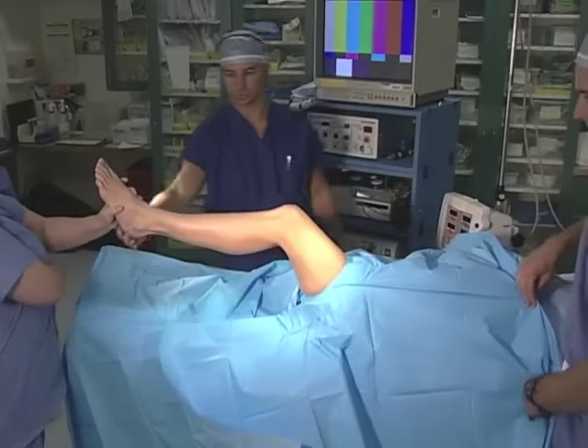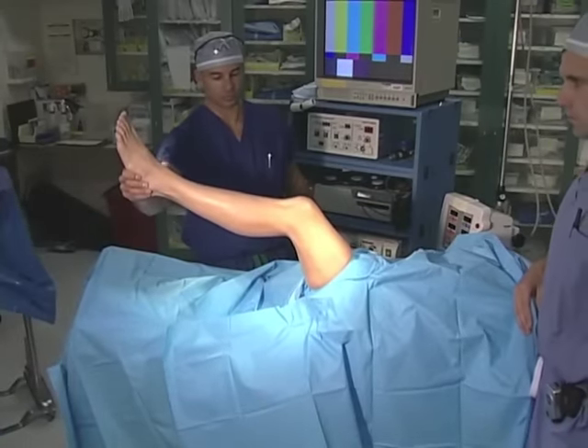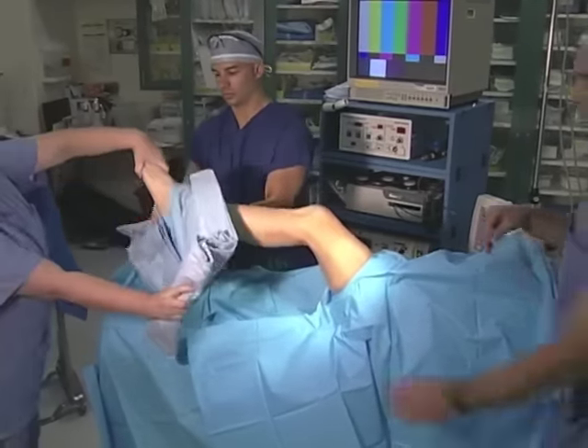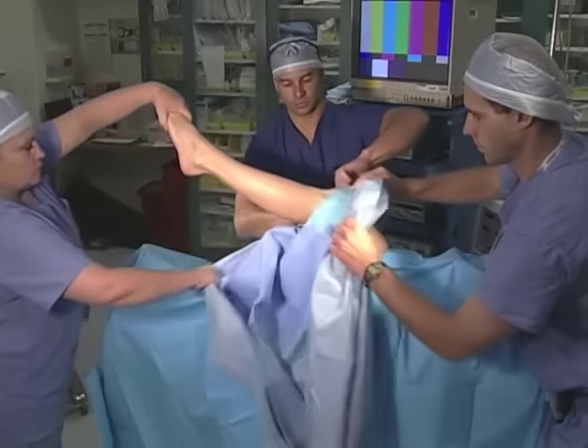Finally, an arthroscopy drape is positioned over the foot. These generally have a hole or diaphragm which seals the arthroscopic fluid and prevents it from leaking up under the tourniquet or off of the arthroscopic field.